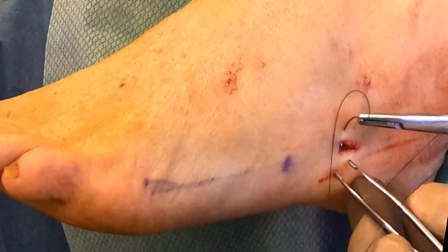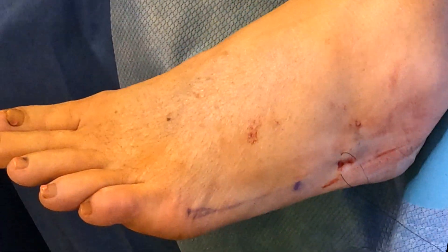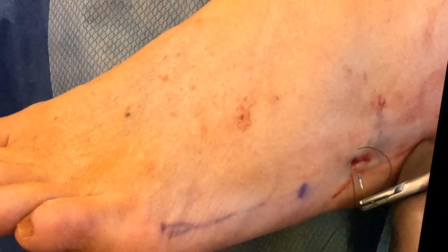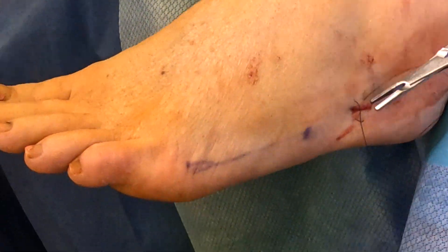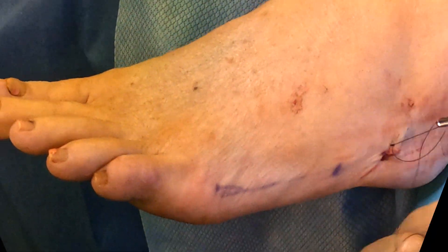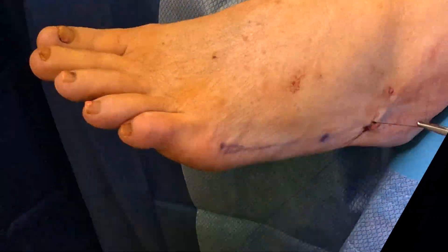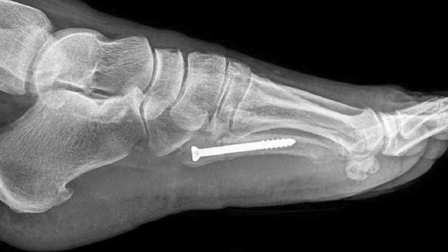Once the screw is inserted, we put in a single stitch — we only need one suture. This recovers very quickly. The suture comes out in about 7 to 10 days and the patient is walking just a few days after surgery. This is a simple procedure.